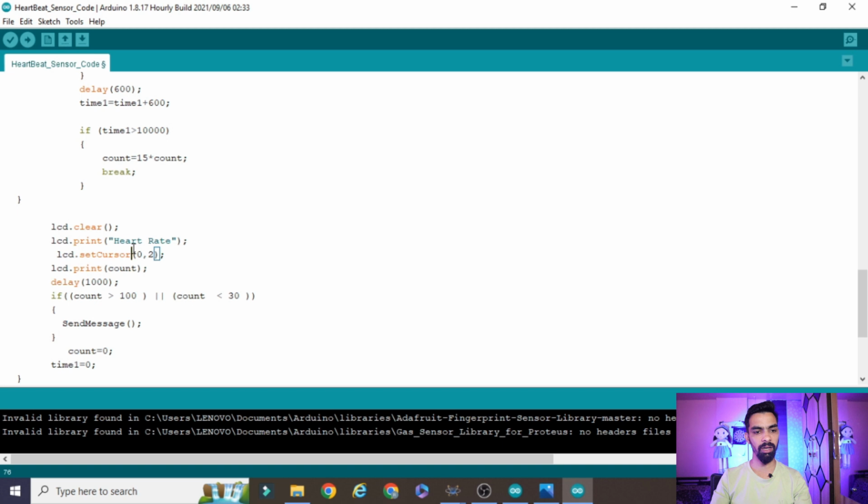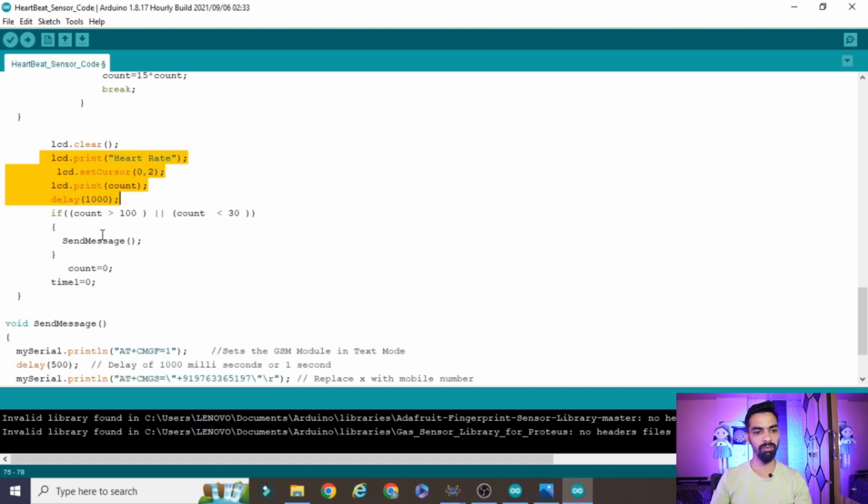Then I have to print that count on the LCD. You can see the count printed on the LCD. Then after that I want to send the message. If the count is greater than 100, then I want to send the message. If the count is less than 30, then also I want to send the message. If the count is between 30 and 100, there is no need to send the message.